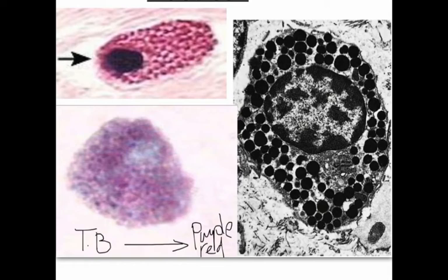As regards the features of the electron microscope, you will see, number one, the presence of these electron-dense granules. These are the secretory granules of this cell, in addition to the features of a protein-forming cell, which are the following: the presence of well-developed RER and Golgi, in addition to mitochondria. What are the functions of this cell?